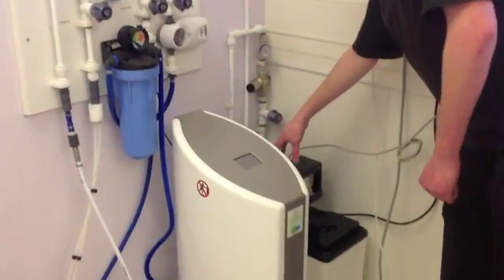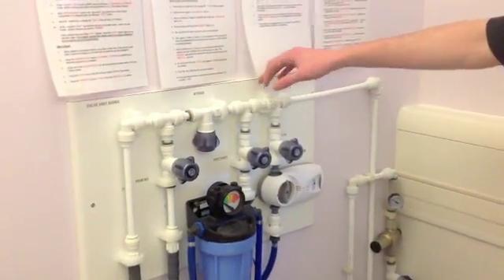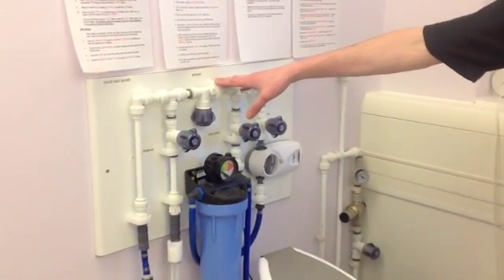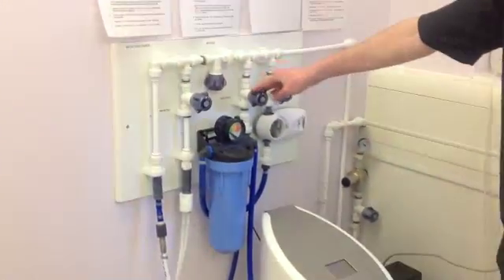The softener does what it does — I will explain to you in a minute — and it will then put the fluid to the valve board assembly. Now your bypass valve will always be closed unless we tell you otherwise, so therefore the water will either go to your test point for when you need to test whether your water is hard or soft.